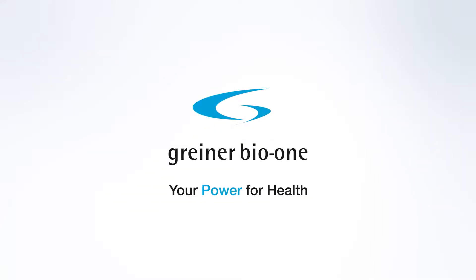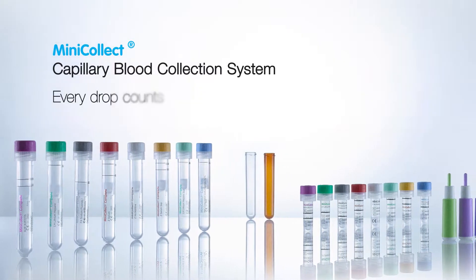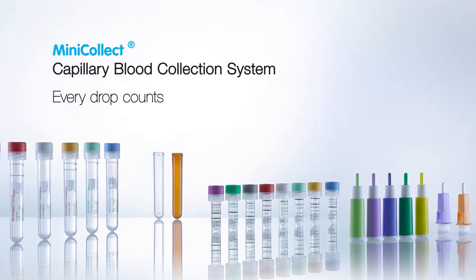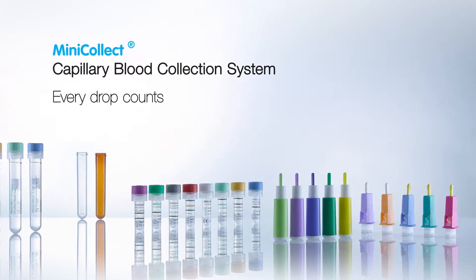Greiner Bio 1 presents the MiniCollect Capillary Blood Collection System. Every drop counts. Venipuncture is not always an option. That is why we have developed an innovative capillary blood collection system to test a wide range of parameters.